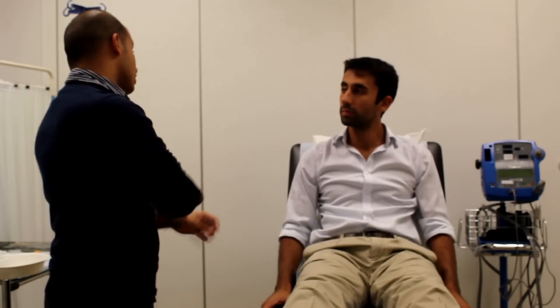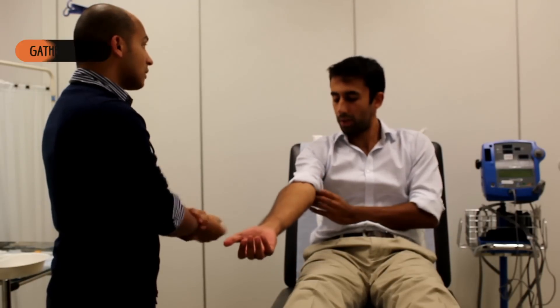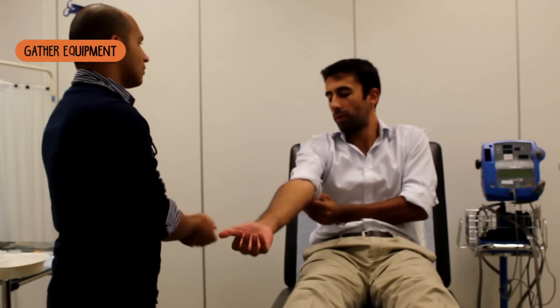Do you mind just rolling up your sleeve and I'll just get things ready? Absolutely. Before we start, can you just confirm your name and date of birth? Yes — Carla Di, 23.05.87.